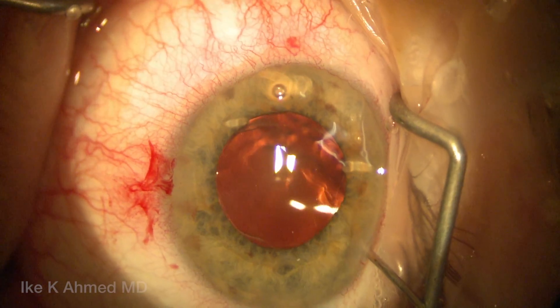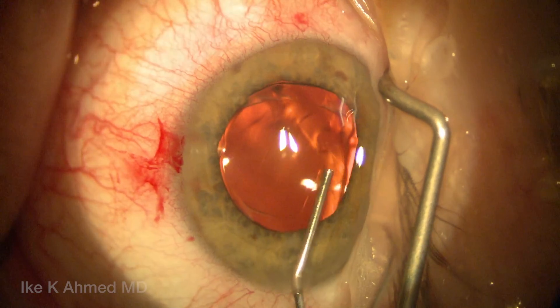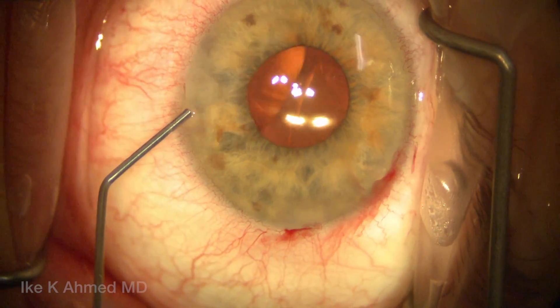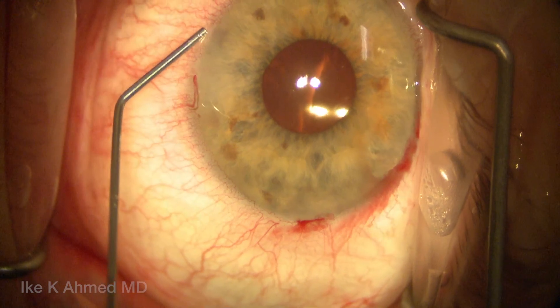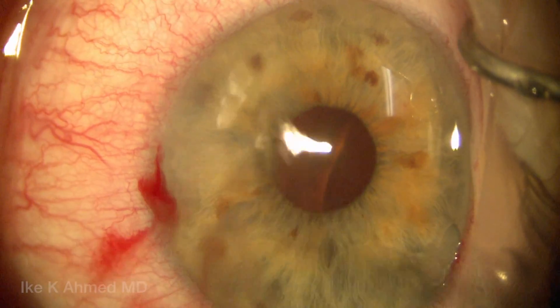We've had excellent success with the complete resolution of negative dysphotopsy symptoms with this technique of reverse optic capture. In the average eye, the IOL certainly sits in a very good position away from the iris and in a stable position held by the capsular bag, with minimum refractive difference.